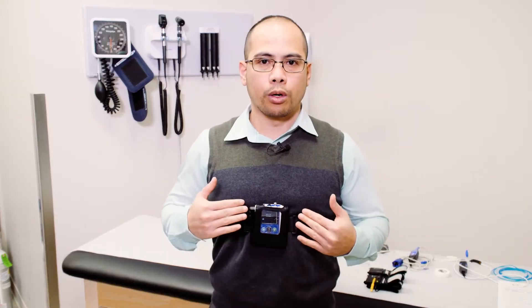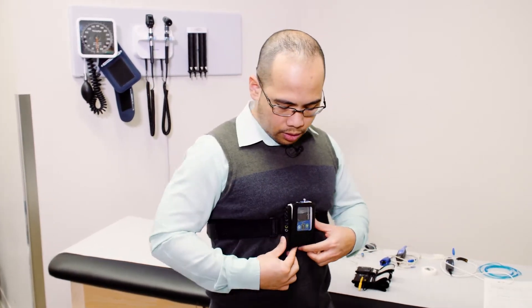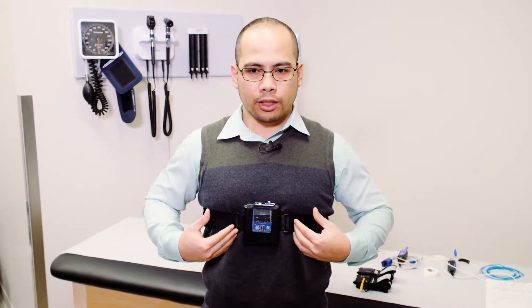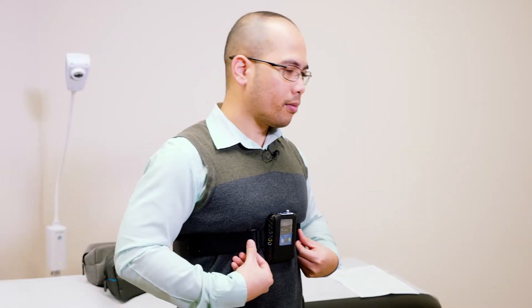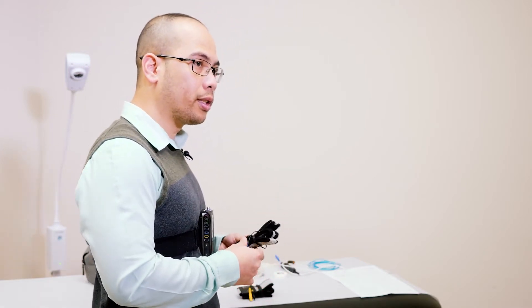The recorder, as you can see, is facing forward. There are ports on the side and on top of it. For ladies, you can place the recorder just below the bra line. Once the recorder is in place, the next step would be to attach the different sensors.